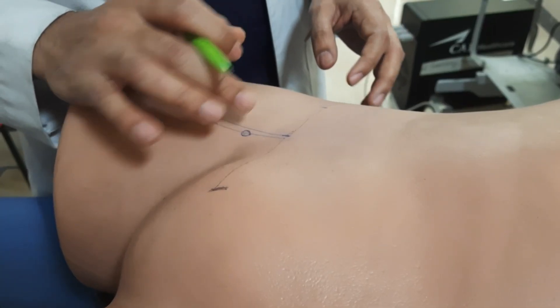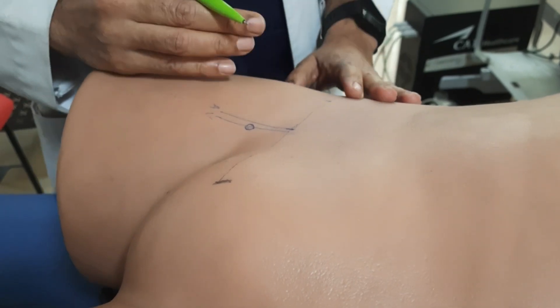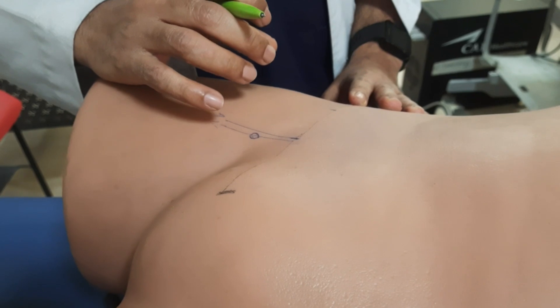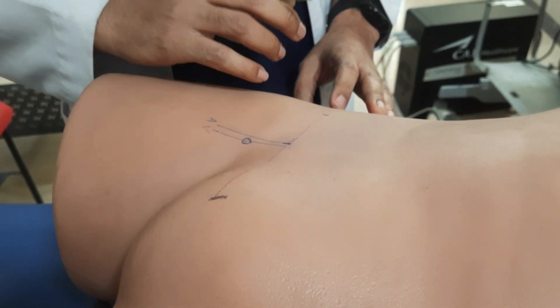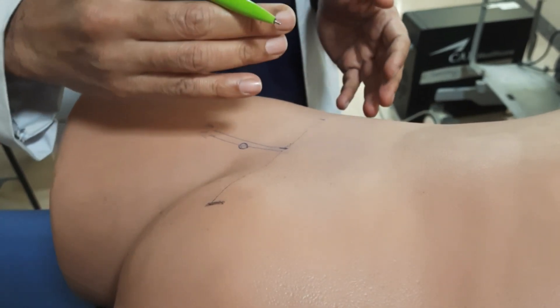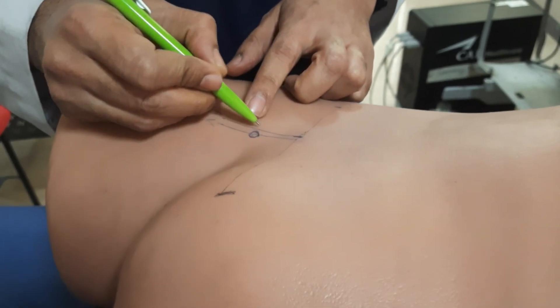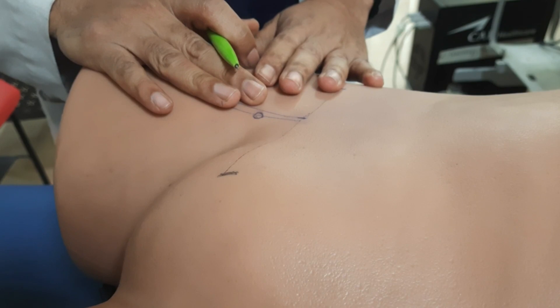After marking, we will clean the whole area with chlorhexidine and povidone iodine spray, because the groin area is an infectious area, so we should take care of infections. After cleaning thoroughly, we put a drape sheet with only this part exposed. So this is our site for femoral vein catheterization.